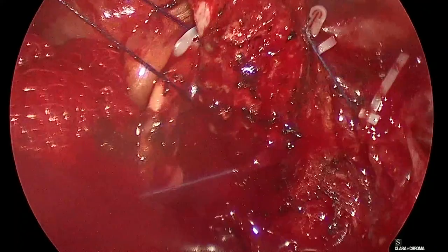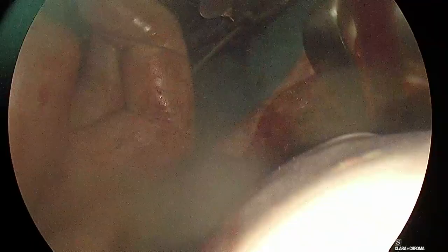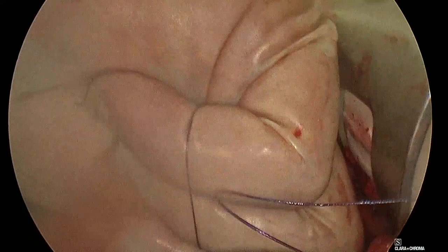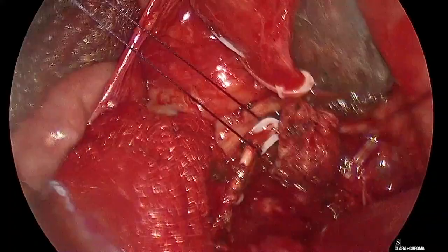Stand here. Okay, let go. Suction, light, better. Give me a forceps, scissors. I need another suture.